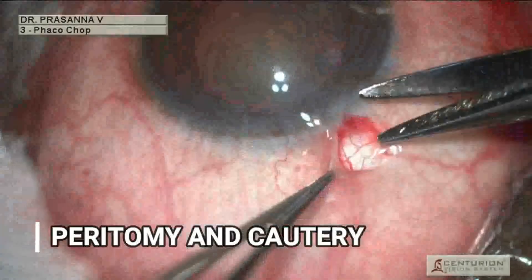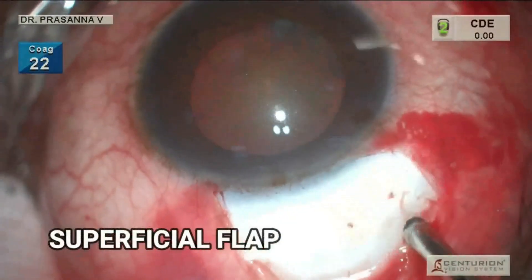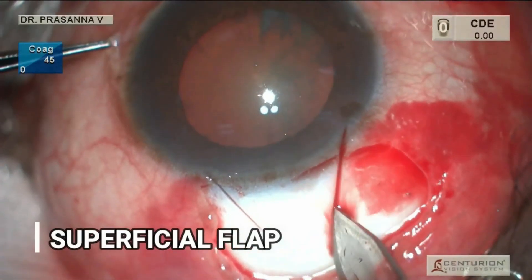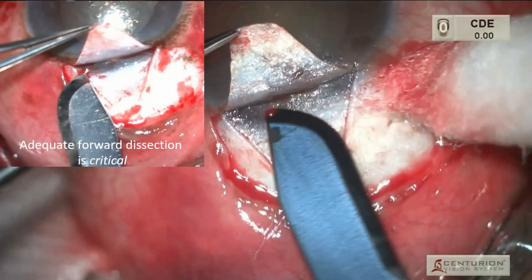We will now see the steps of NPDS. As with trabeculectomy, we make a superficial flap, but cut at the limbus with adequate forward dissection.